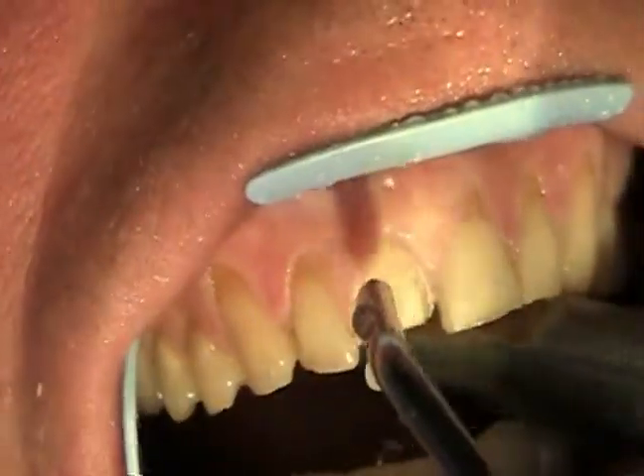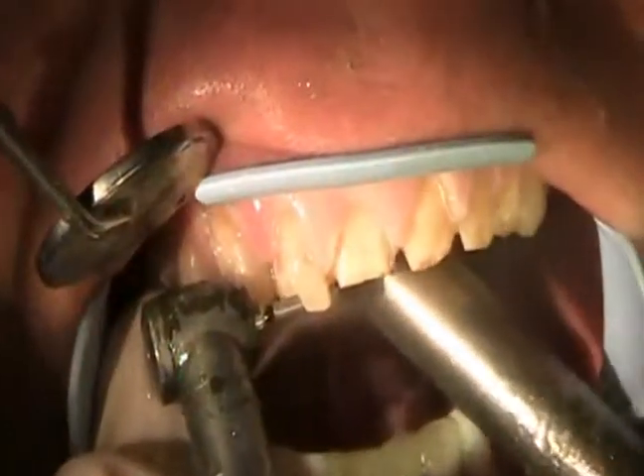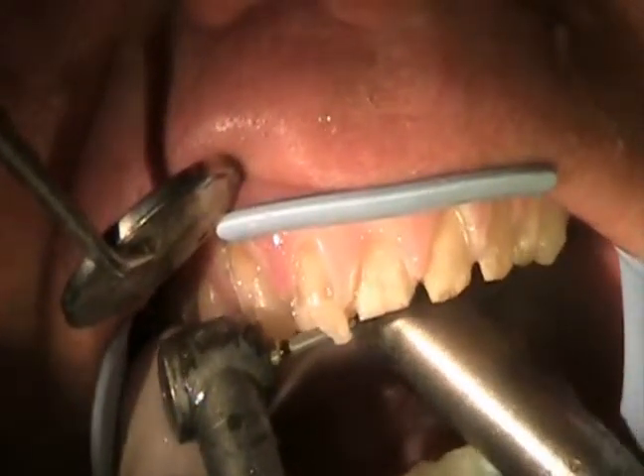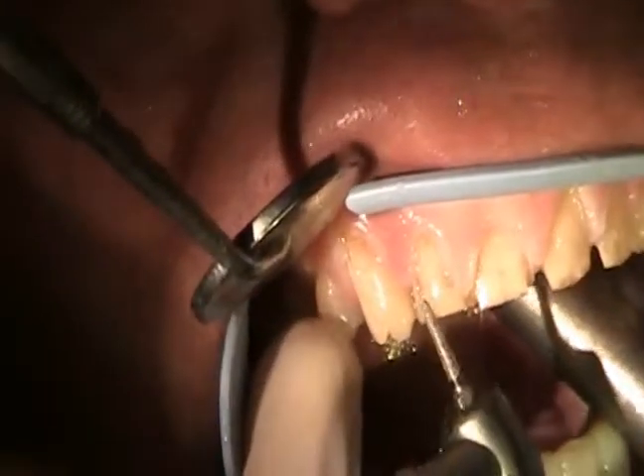Now we'll go ahead and continue this process. We've got six teeth that we're going to take care of today, so that'll end up working out real well for them — they'll end up with a beautiful smile after this.